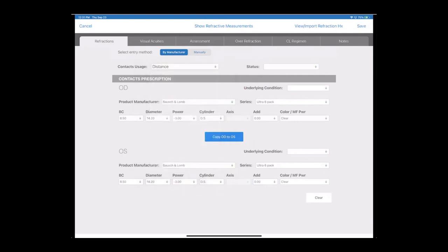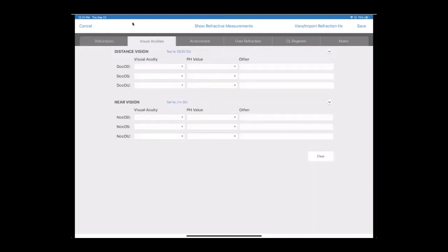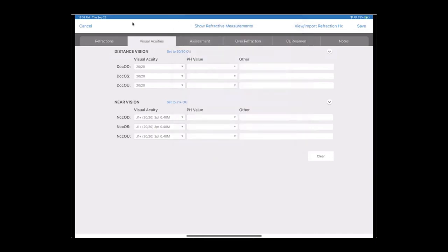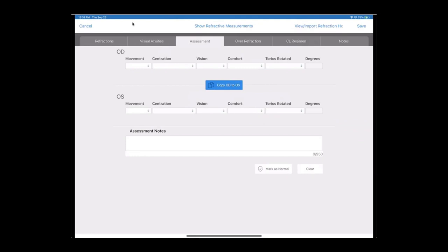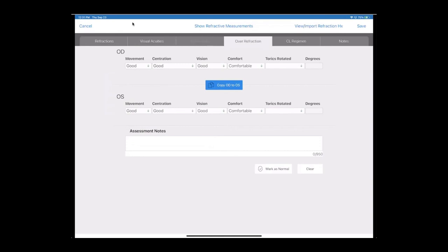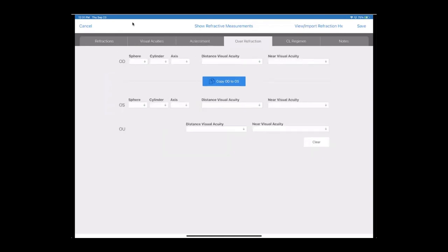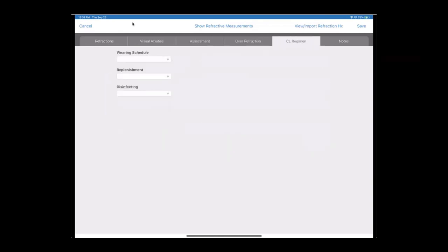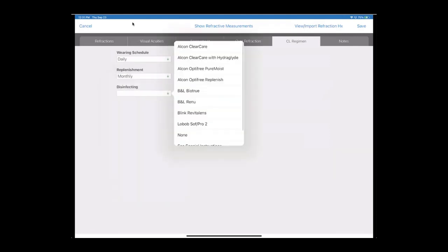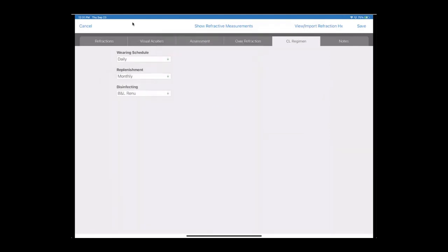Then while we're in the same screen, we can go right into the visual acuities and assessment. We can set everything to 20/20 if we want, or use the dropdowns to notate other values. Same concept for our assessment. We can mark everything as normal or use the dropdowns. List an over refraction if there is one, and then our contact lens recommended wearing regimen. And save.